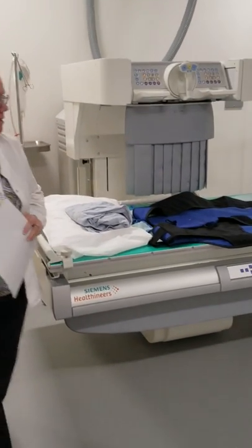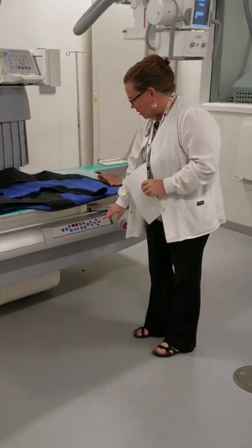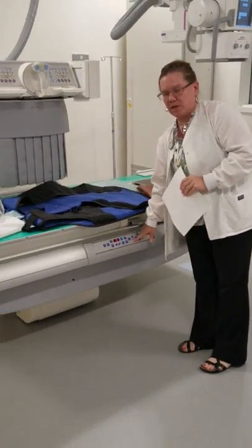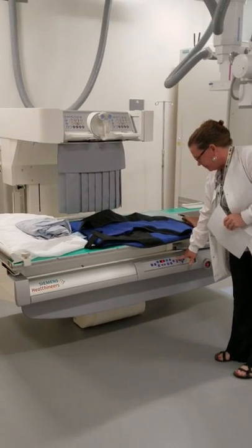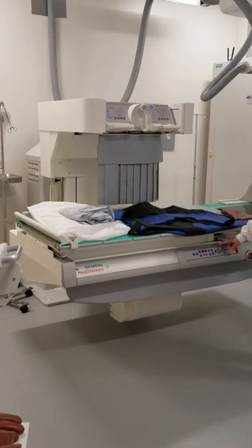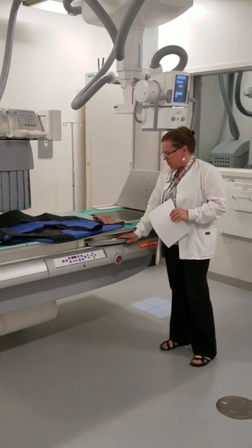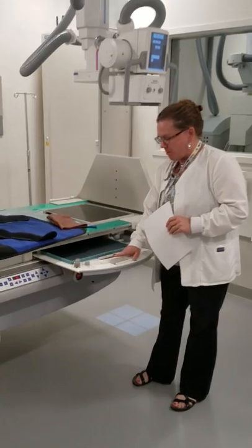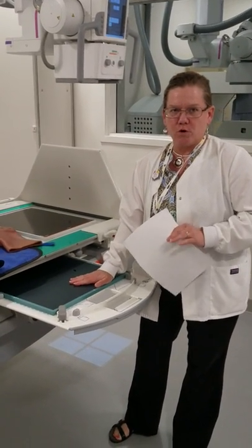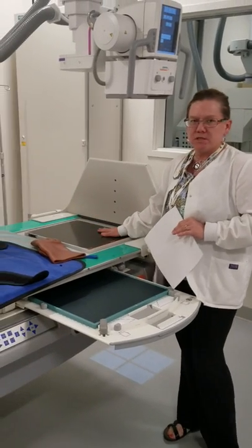Once your patient is in the room, if it's a tabletop exam, we can actually lower our table down so the patient can get up on it a little easier. If it's an exam where we're using a table bucky, we can use what we call a CR cassette — a computed radiography cassette — or we can use a digital detector.